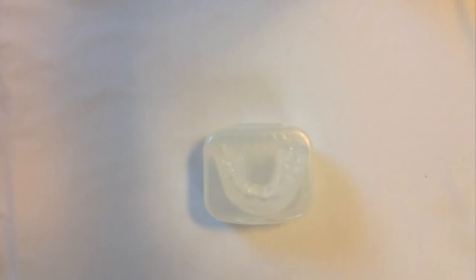The next question that you may have has to do with the comfort of this device. As with any other mouthpiece, it's going to take a couple days to get accustomed to wearing it. You may experience some drooling, as I did for the first 2 nights. But after that, it actually is very comfortable to wear. It's something you kind of get used to, but something you have to really give a chance. Give it a couple days, try it out, and then it becomes more comfortable as time goes on.